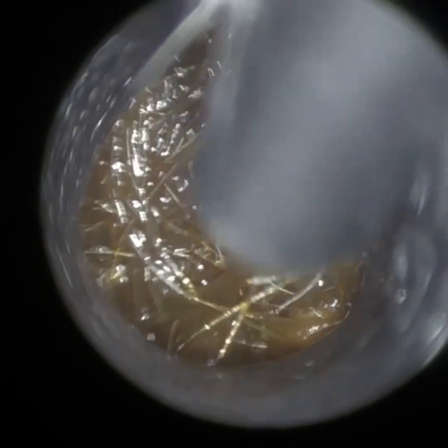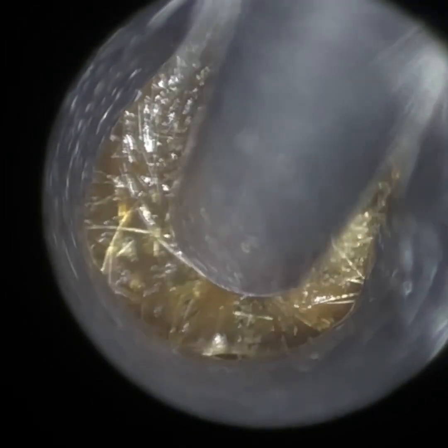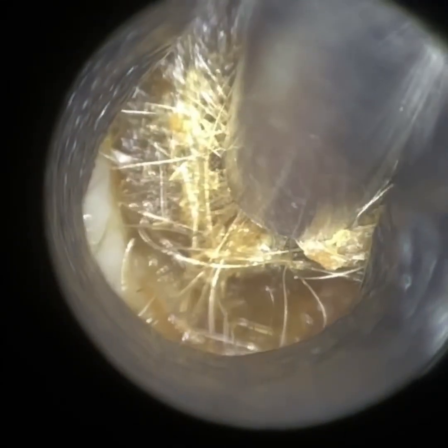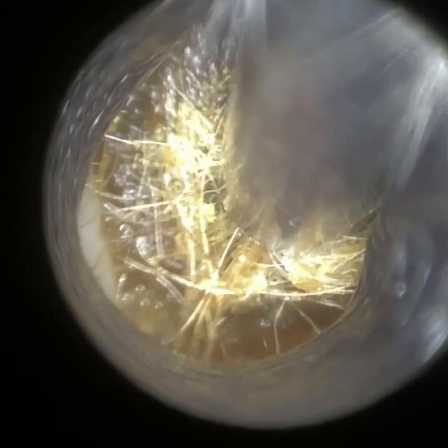We're just starting off in the left ear. They've got extremely hairy ears and very narrow ear canals as well. This wax is like a boulder — it's really solid and embedded.